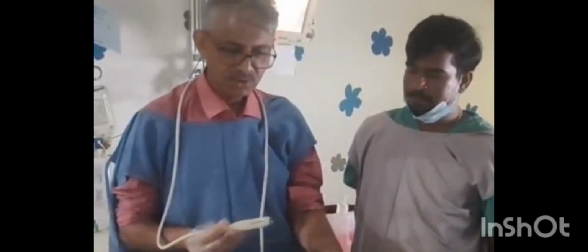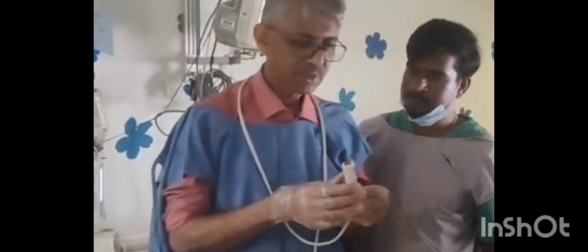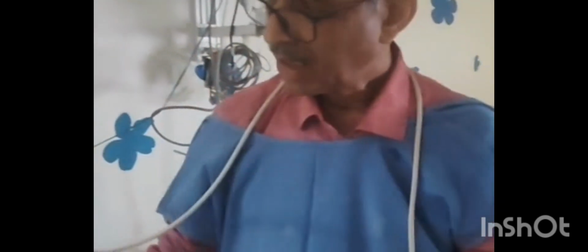So for that, you take a probe which has high frequency. Here we use a 4 to 12 frequency probe. It's also called a footprint probe. Make sure that the baby is sleeping, so that the baby will cooperate for your examination. And always use warm gel. And this is the area you have to choose.